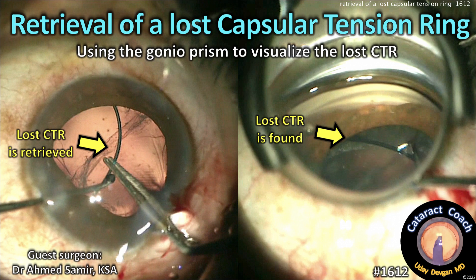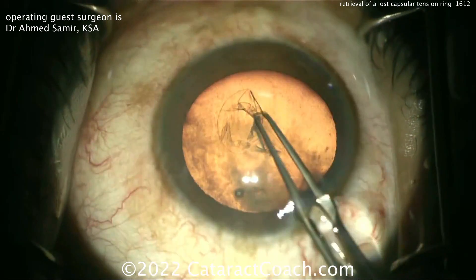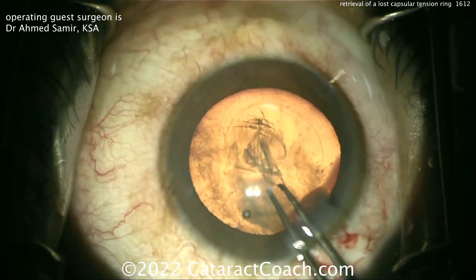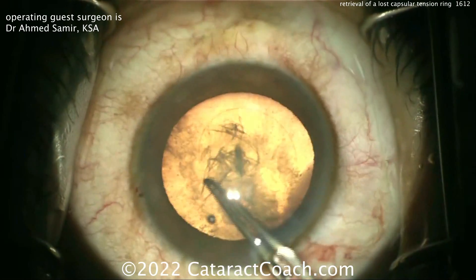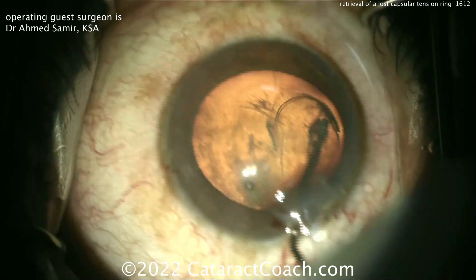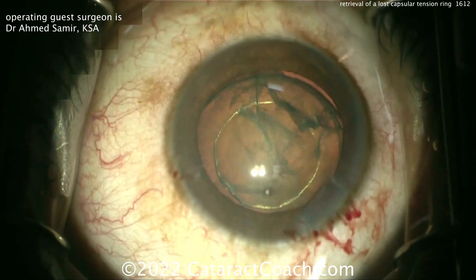We've all thought about this. Let me show you how it actually happens. Our guest here is doing a routine cataract surgery. Looks like a pretty reasonable cataract. Good-looking capsular rhexis, that's completed normally. Everything looks pretty reasonable here — pretty much a routine case. Well, maybe not so much. Watch carefully. Hydrodissection being done right now, then hydrodelineation, and now time for nucleus removal.